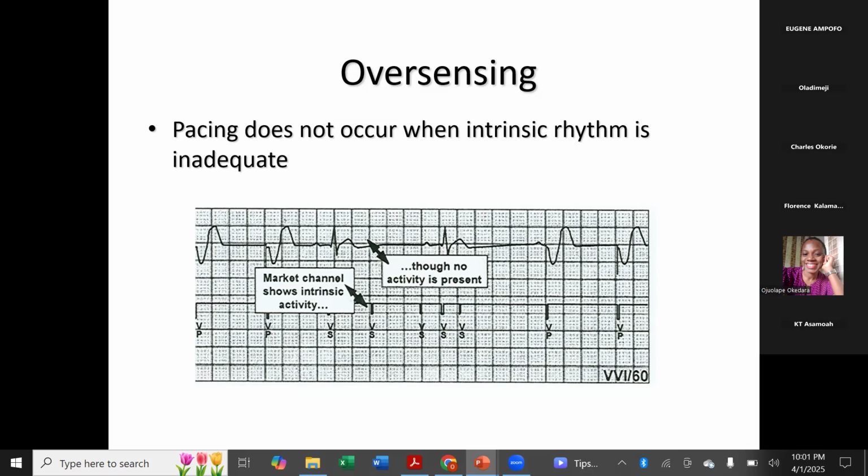I want to be sure we got that. These are things we just program on the programmer. It's not hard at all. So what I'm saying in essence is that if the sensitivity voltage for this patient is 1 millivolt, it's going to sense P wave. Remember this is single chamber. He has only single chamber. So if he's seeing P wave activity or T wave activity, he's going to sense it as ventricular activity.